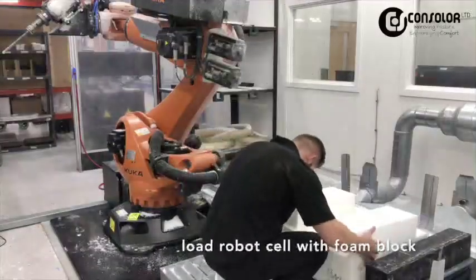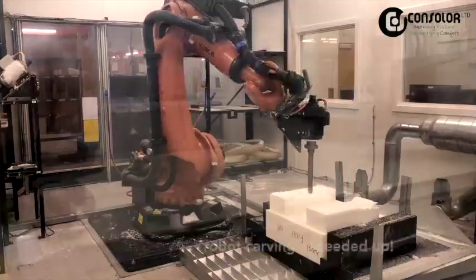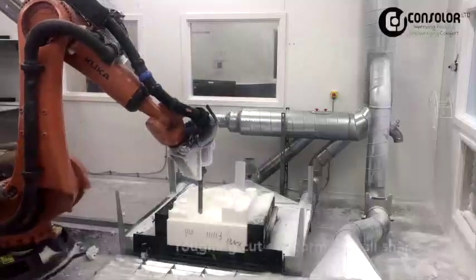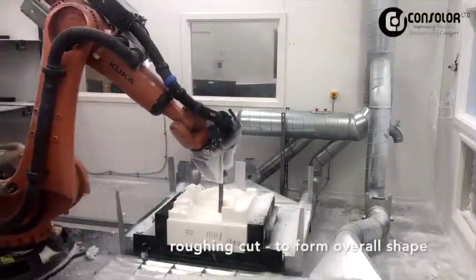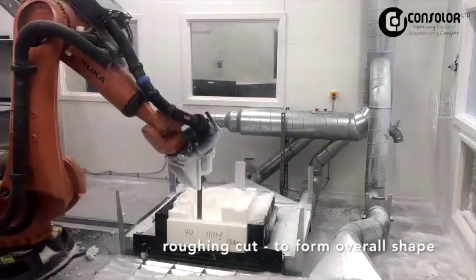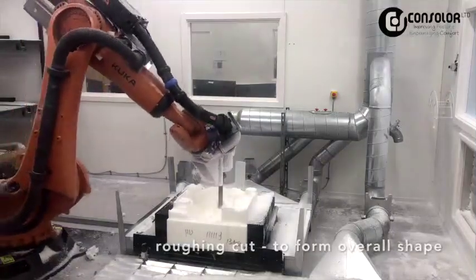The robot cell is loaded with an appropriately sized foam block and the machine is started. We've speeded up the film here, showing the robot carving a backrest cushion. First a roughing cut with a large diameter tool, then an automatic tool change for a smaller diameter tool to produce all the fine detail in the finished cushion.